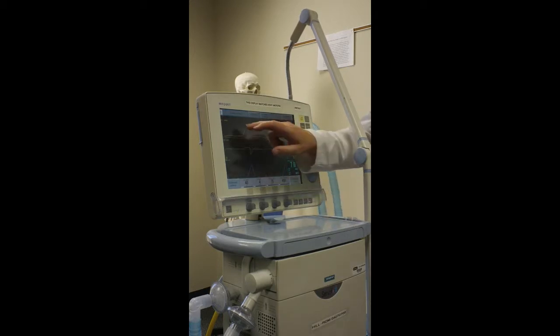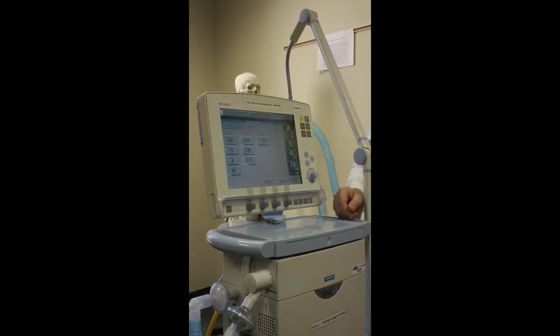And remember on this ventilator here, you can get some of those down here. The others are there. Sometimes you're not going to see some of them right here, but on this one, there's a box here. This little box tells us our I to E ratio and some other things. But those are all set. So then the next section is our patient. This is what we've set. What's actually happening is what you're going to record next.